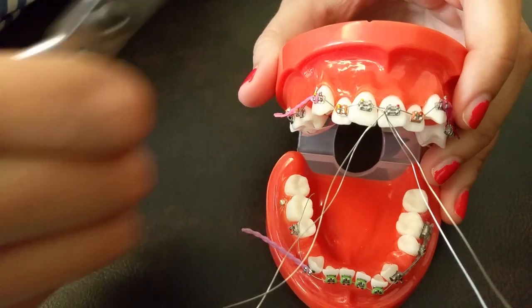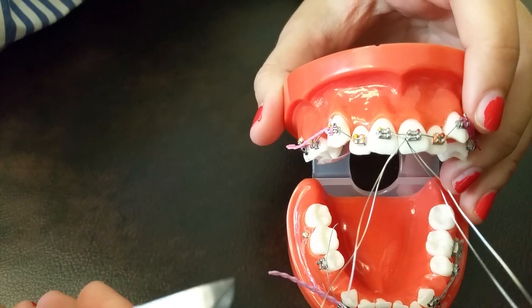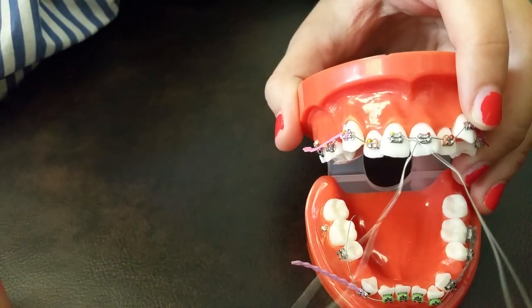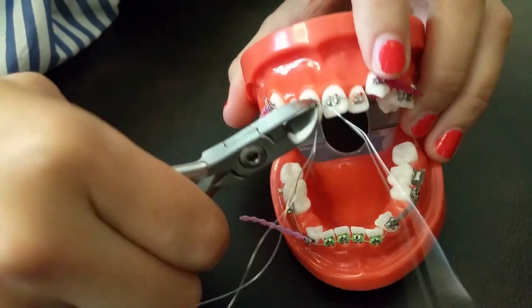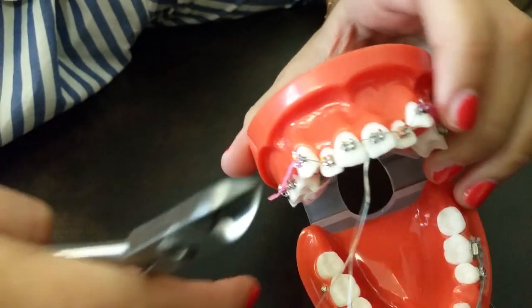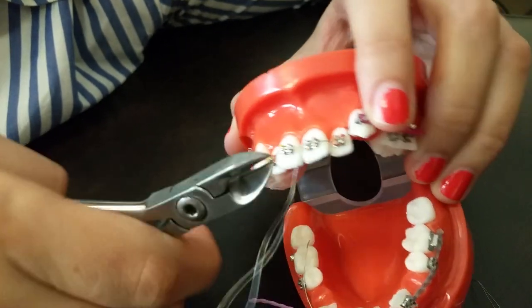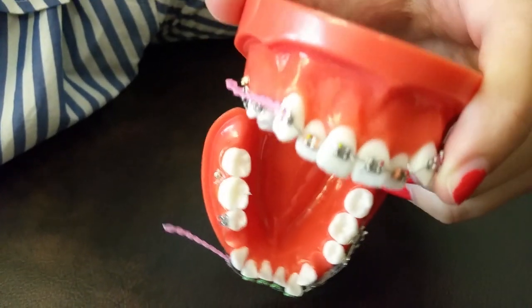Now I'm going to cut the excess wire. You can either do them one by one, but I like to do them all at once because it saves time. You want to cut enough so you can tuck it under, but not too long so it doesn't stick out. I'm using a straight cutter, and you want it to be about that long.